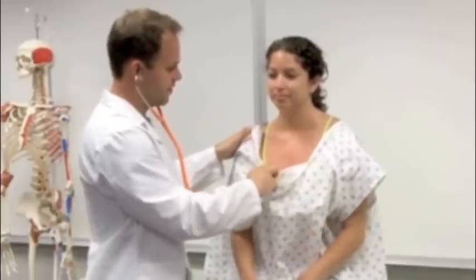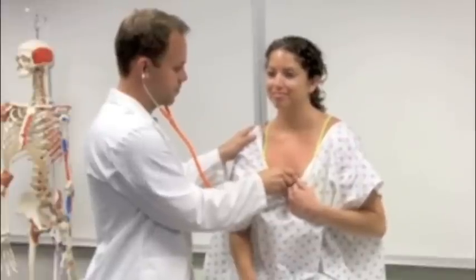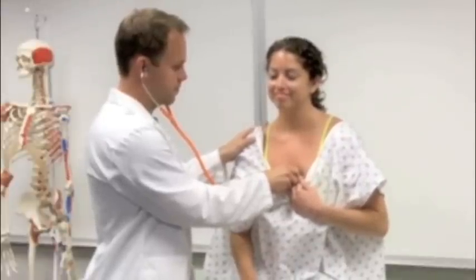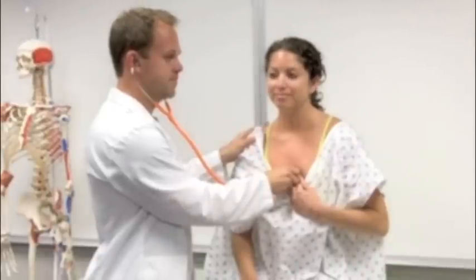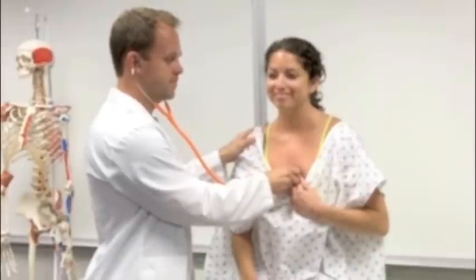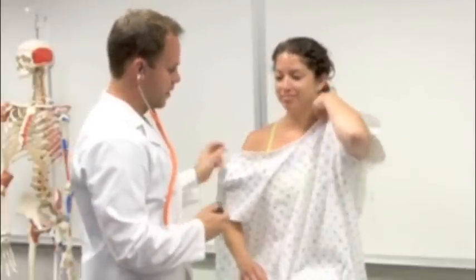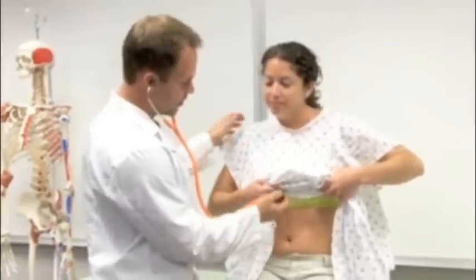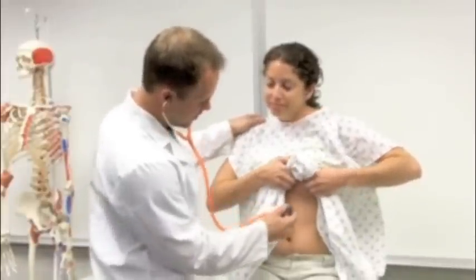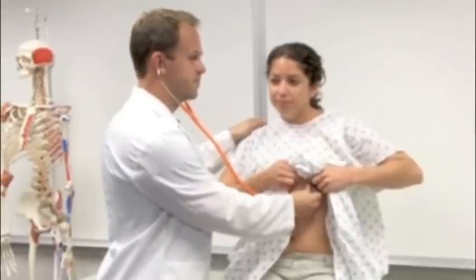The patient is asked to assist in lowering the gown for access to the tricuspid valve. For better access to the mitral valve, the patient is asked to lift her gown and breast tissue out of the way. Again, paying careful attention to the clinician's eyes.